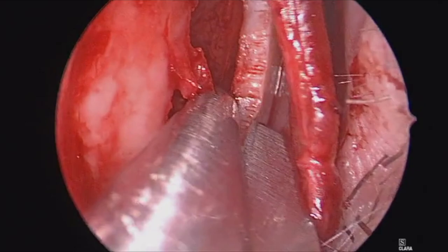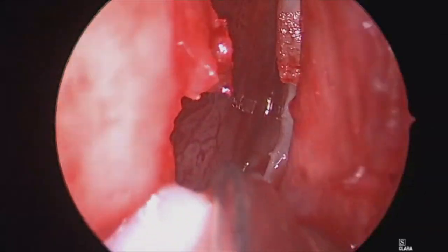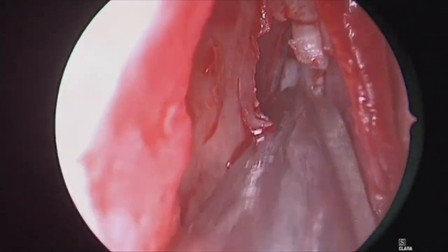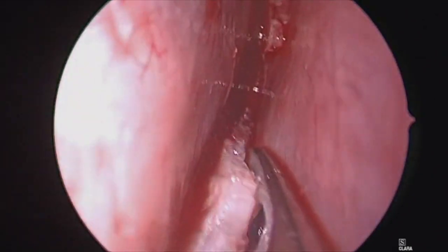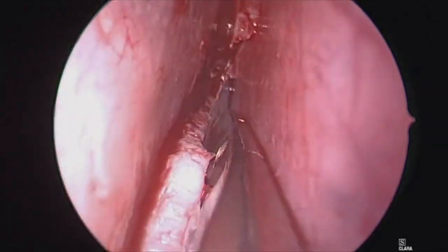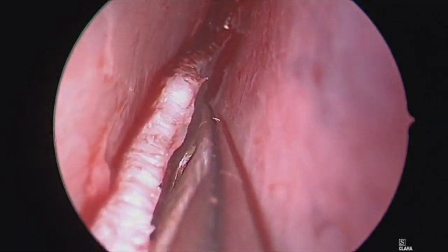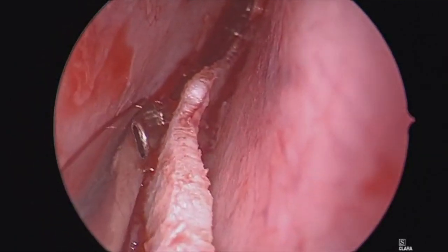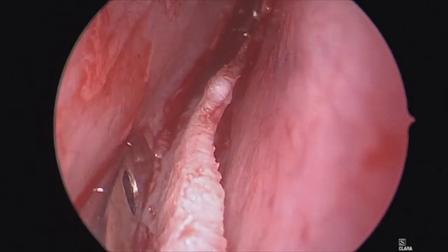Once the cartilage has been isolated on both sides, you can use an instrument like the open Janssen-Middleton forceps to create a larger window by removing some of that deviated cartilage and bone. We'll begin to work low in the nose at the junction of the cartilage with the maxillary crest. This can be a tricky part to elevate as the mucoperichondrium transitions to mucoperiosteum over the maxillary crest, and the key here is isolating that remaining cartilage to reduce the risk of a tear in the flap.